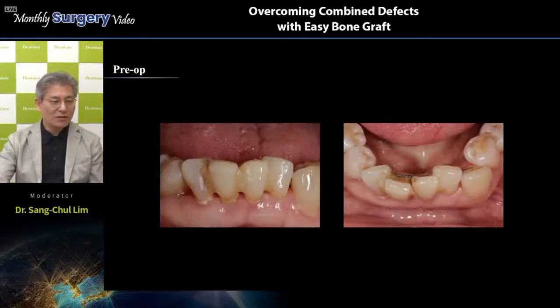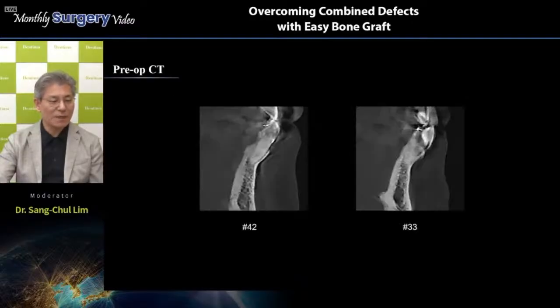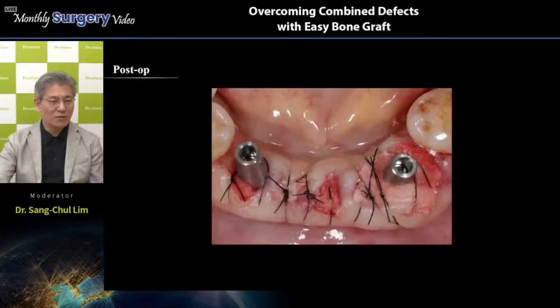The pre-op intraoral view. As you can see, the lower 4 anteriors are splinted with resin and wire. The periodontal condition was poor, root resorption had happened, and the bone condition was poor. However, number 33 looks intact compared to the lower 4 anteriors. This is the pre-op CT view, number 42 area and 33 area. A very thin cortical bone plate and a narrow ridge were seen in both areas.